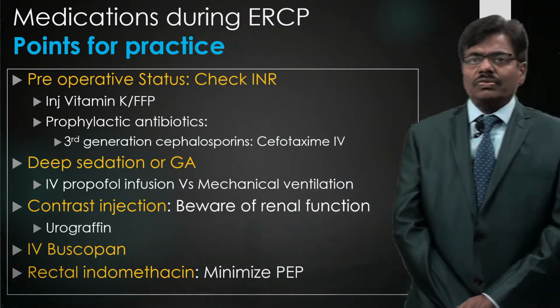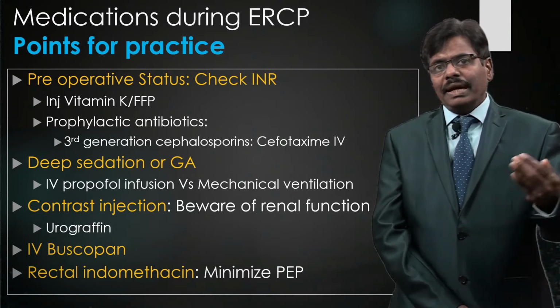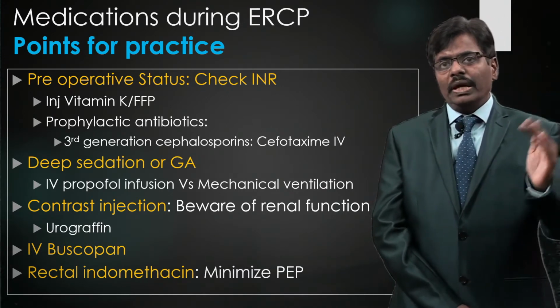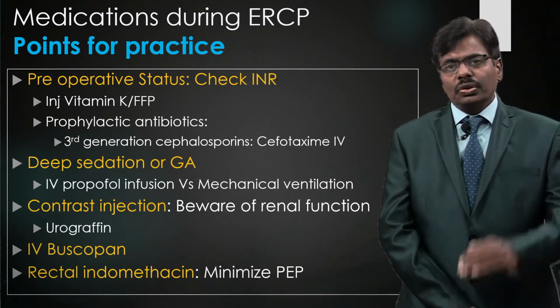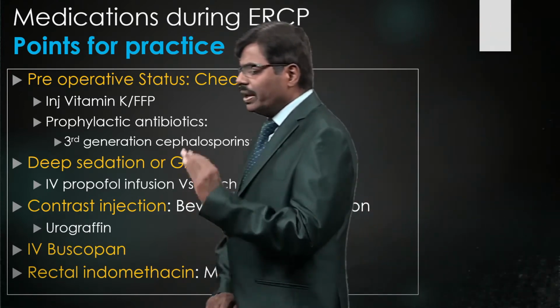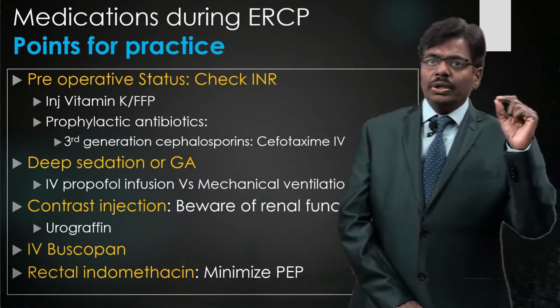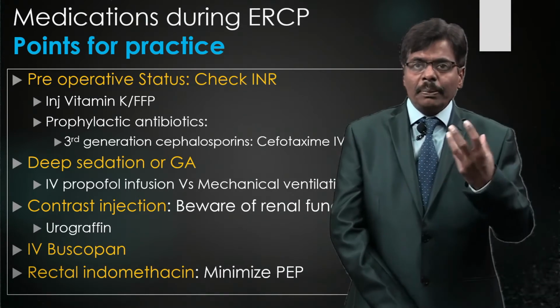The same contrast we use for the CT. Even though it can be excreted by the kidney, better you ensure the patient's creatinine is not too high. And usually my recommendation is to go for 1:1 dilution of the contrast, so that you minimize the amount of contrast. And also my dictum is never fill the obstructed system unless you are able to go above it with a guide wire and into the catheter, because there is no point in pushing under pressure the obstructed system.